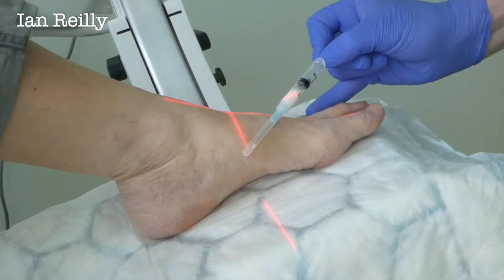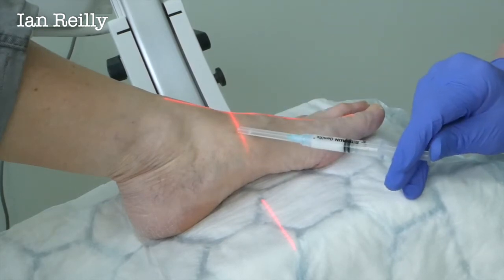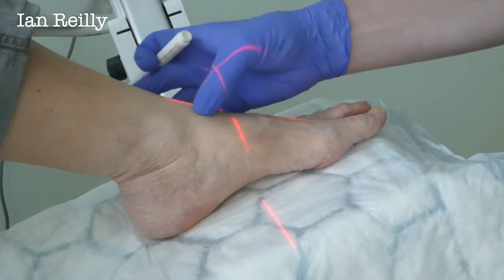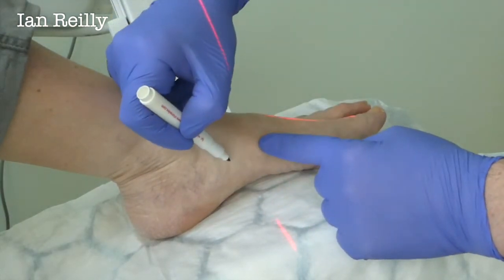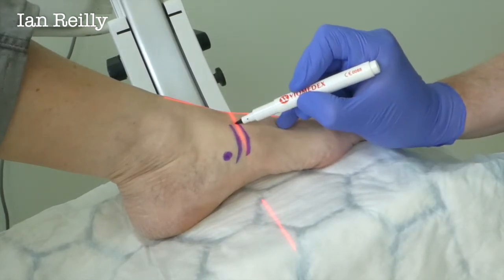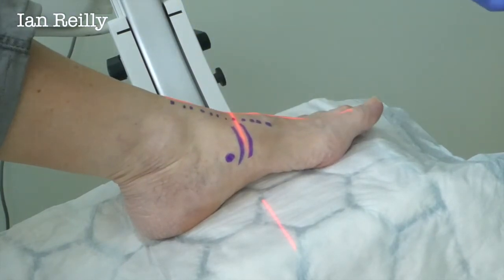Okay, we're not a million miles away at all. We're going to come in more about there — that's really close. So let's just mark up the anatomy, Kathleen. Here is the high point of the navicular, and your joint that's arthritic is really around there. We've got a tendon here and a tendon here, which would be a good thing not to inject.